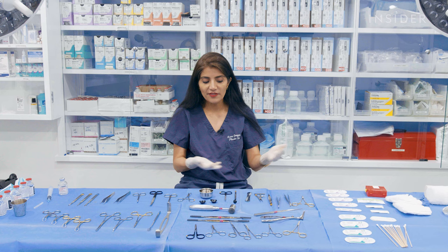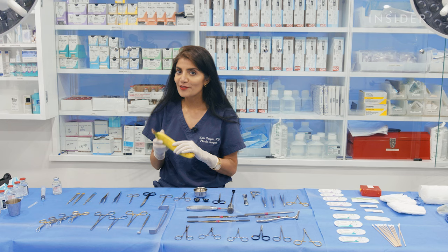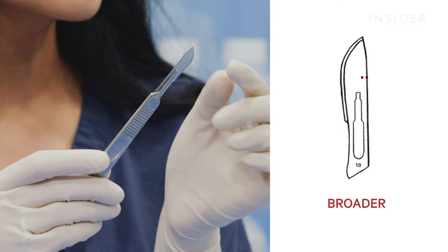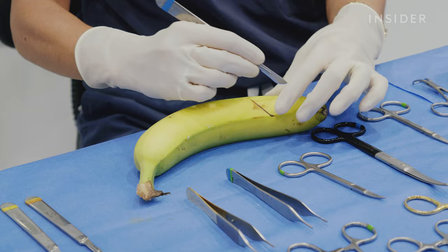The first things that I'm going to show you today are one of my favorite aspects of my job, which is the scalpels. And so I brought my banana from lunch, and I'm going to demonstrate these knives for you. This is a 10 blade, and you can see that the belly of a 10 blade is broader and more curved. So I'll frequently use a 10 blade for an operation like an abdominoplasty or a tummy tuck, where I'm making a large and swift incision.